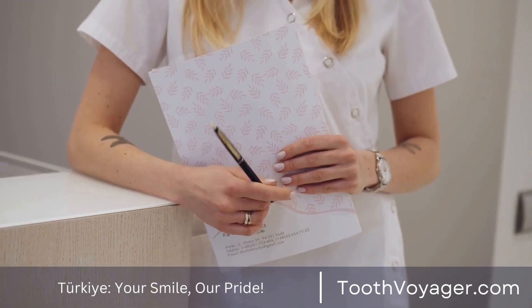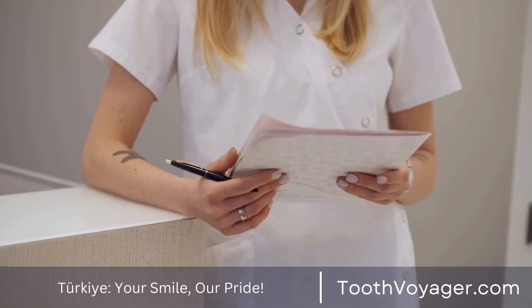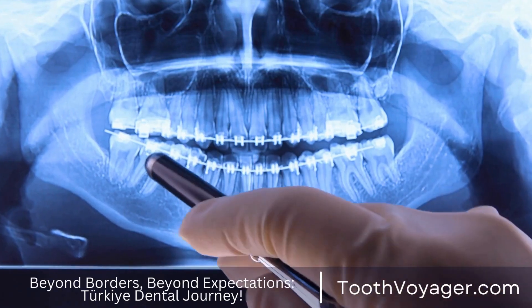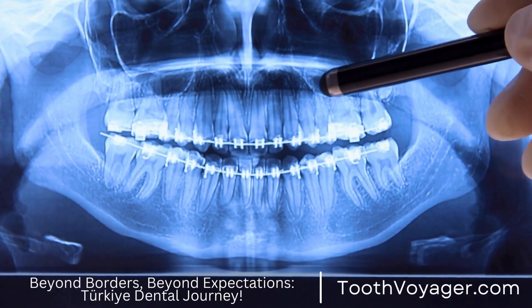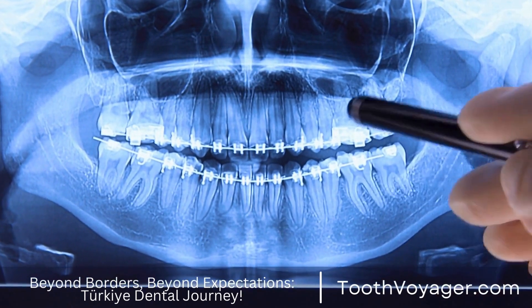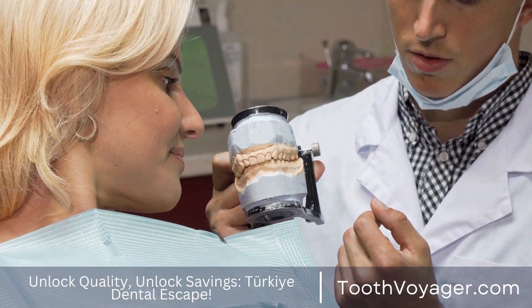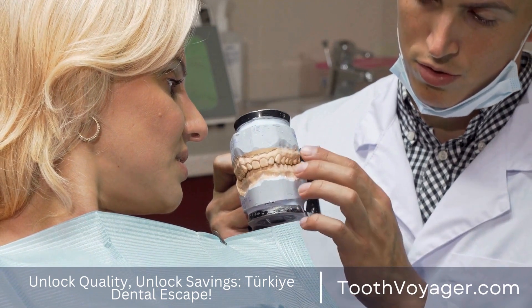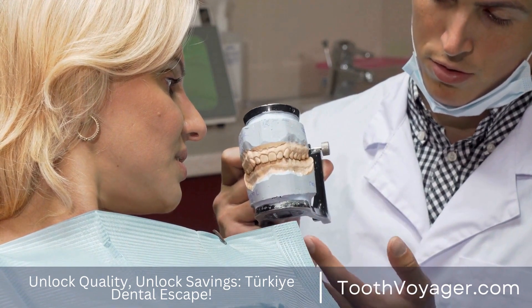The traditional bridge is the most commonly used kind of dental bridge. They are usually used for situations in which there are natural teeth on opposite sides of the missing tooth. The false teeth are connected to crowns, which are then cemented onto the natural teeth on both sides of the gap.